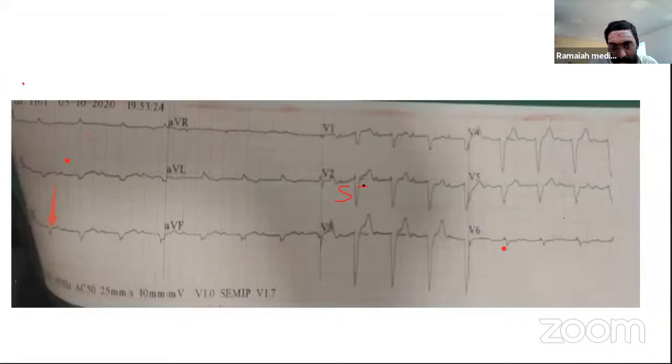ST changes, there are some ST changes. You can see here there is ST depression and T wave inversion in I and aVL. Whereas here there is a sharp shooting of the ST segment in the inferior leads with the QS here. Then there is poor R wave here. So all of this, and very peculiar, there is one finding.